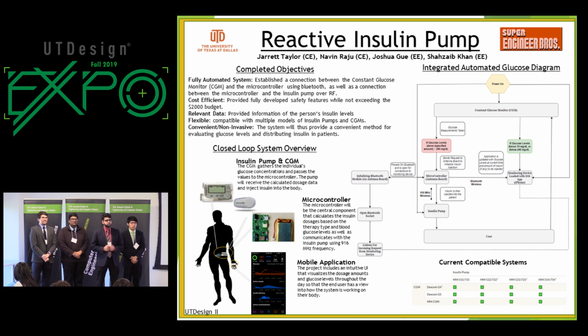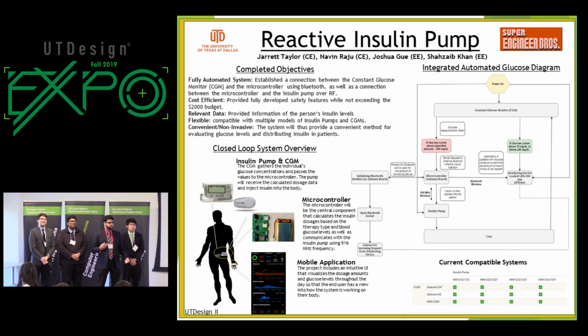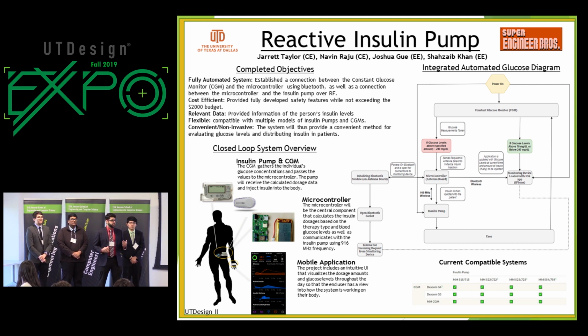We have a constant glucose monitor, which is in charge of just measuring your glucose levels. We have a microcontroller that does all the processing and algorithms we got from different endocrinologists over the semester, and a mobile application which acts as a monitoring tool for all errors that may occur during the process. It contains redundancies and warnings, and it tells you when your insulin is actually being pumped into your body.